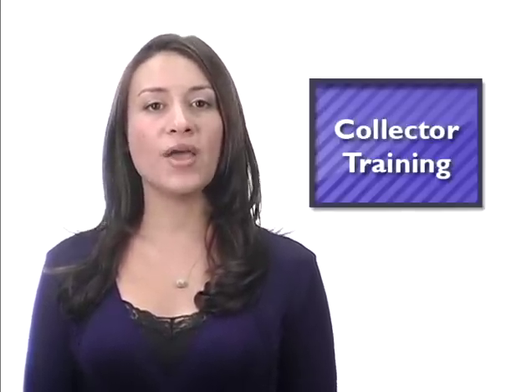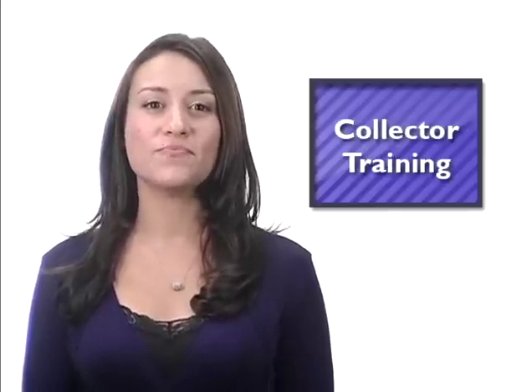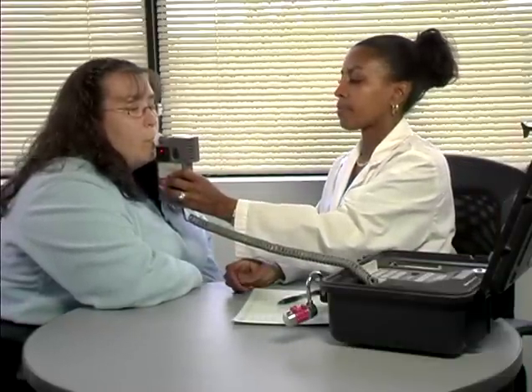Also, you should not wait for authorized representatives of either the employee or employer to arrive. There are, however, a couple of situations that take precedence over a DOT urine drug screen collection. If a DOT alcohol test is also required, it should be completed before a urine collection. Medical treatment must never be delayed for a urine collection. For example, in a post-accident testing situation, the donor must receive necessary medical attention before a collection is attempted.